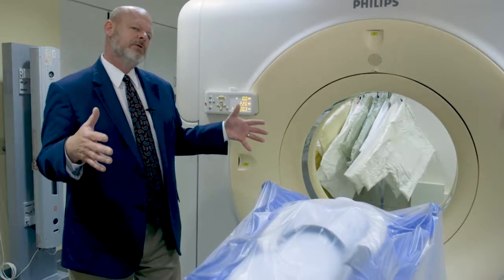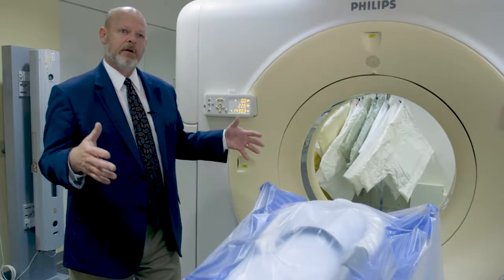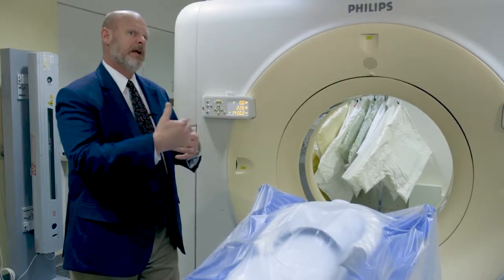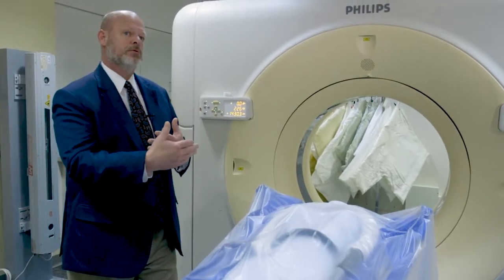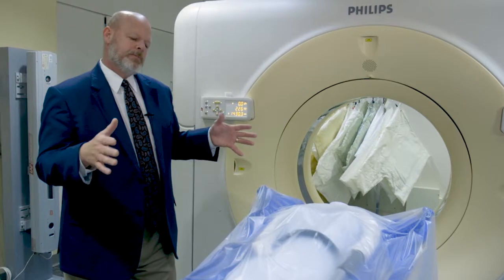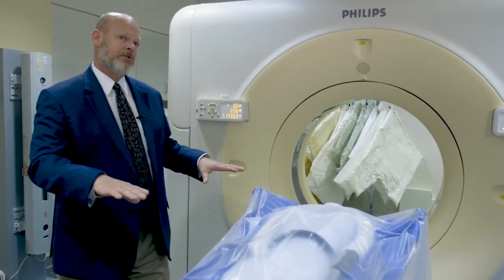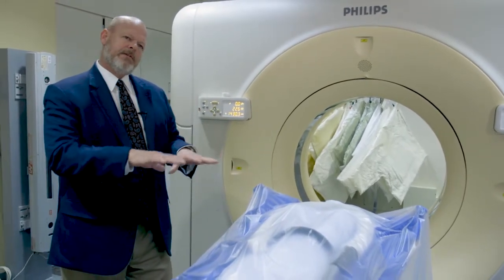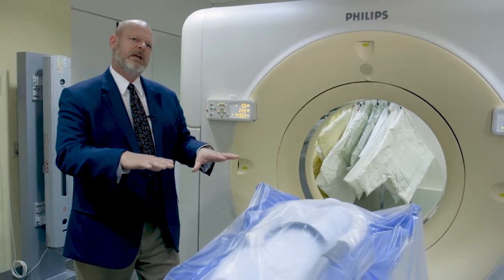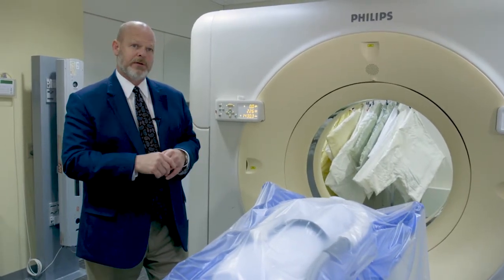The first step is to do a CT simulation. This is a typical CAT scanner but it has some unique tools with it. We're able to place the patient in a position that they'll be comfortable in and that can be reproduced in that same position each and every day when we treat them.